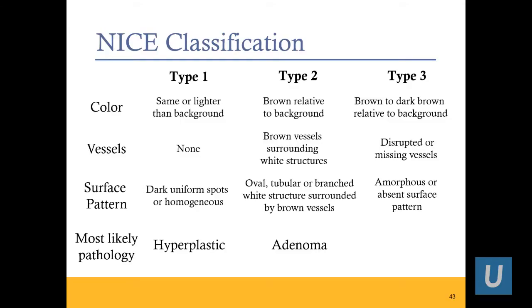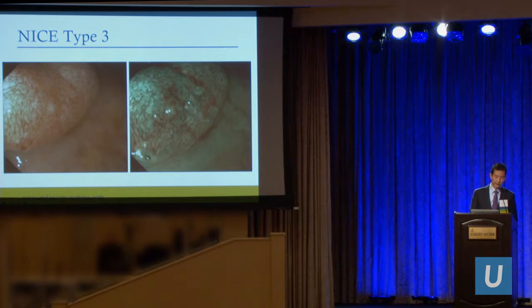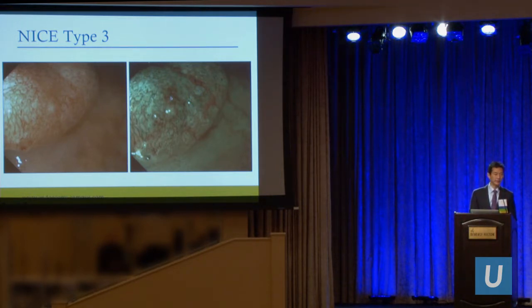Type 3: dark compared to the background, disrupted or missing vessels — that's a very important distinction — and an amorphous or absent surface pattern. These are considered deep submucosal invasive cancers. Here's the white light picture and the narrowband imaging picture: you can see the loss of tubular structures and missing vessels. This is more concerning for a cancer. It's not rocket science — a simple push of a button on your scope can help you differentiate between a hyperplastic polyp, an adenoma, and a cancer.